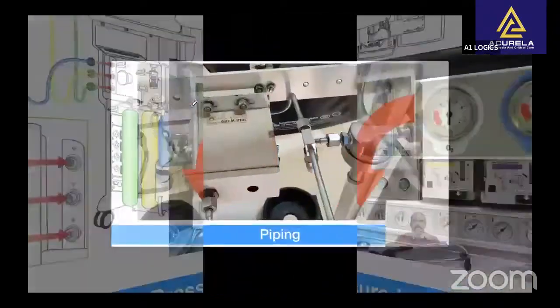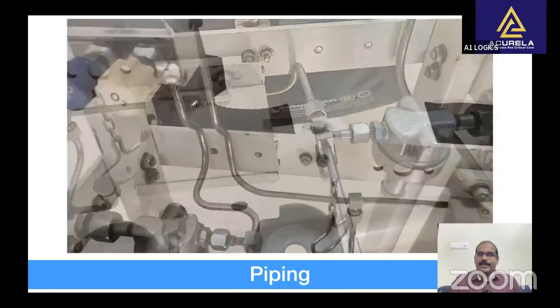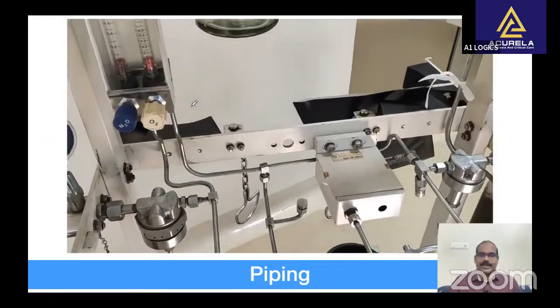Now, piping. It is used to connect the components inside the machine. It must be able to withstand 4 times the intended service pressure without rupturing.